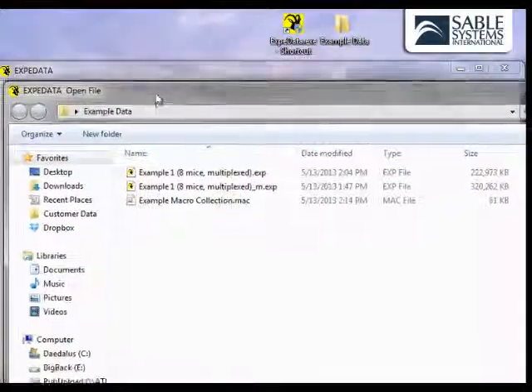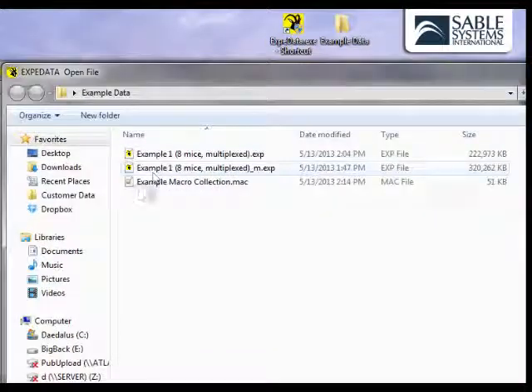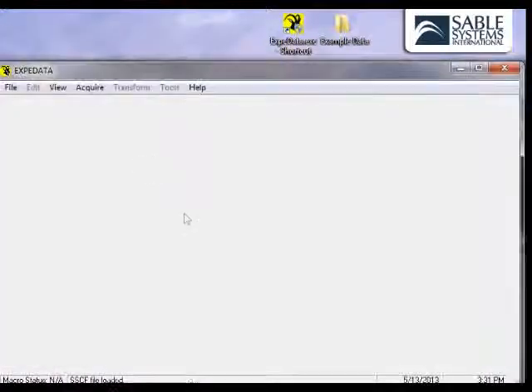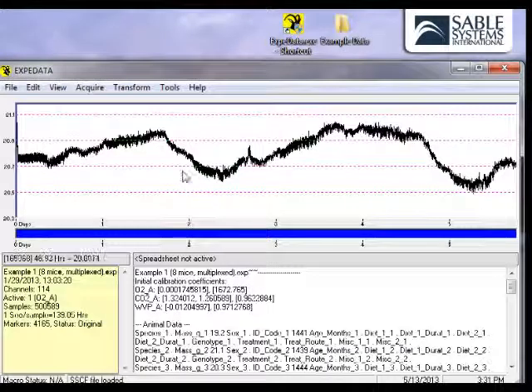After the file is loaded, you can see the first channel on the graphics screen. Let's load — and there is our first channel.